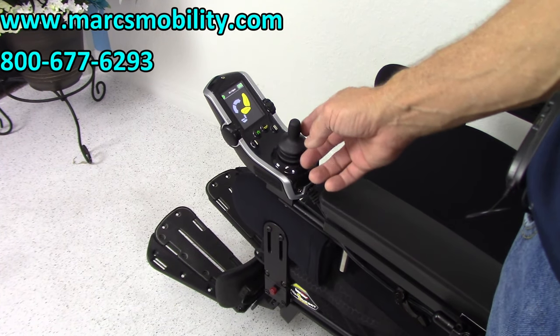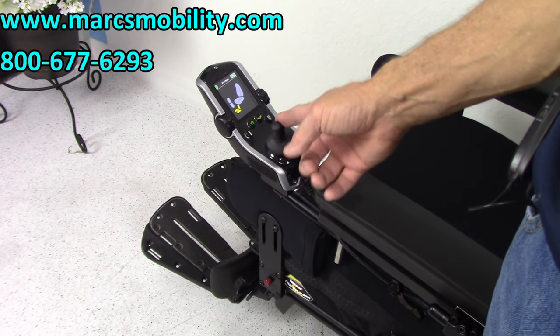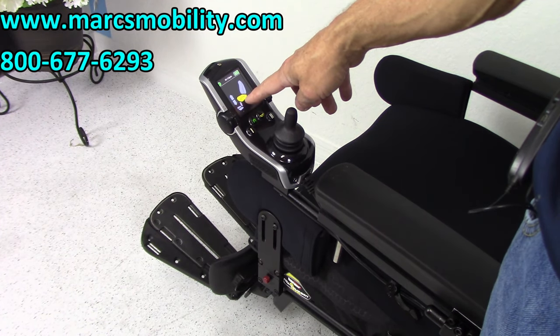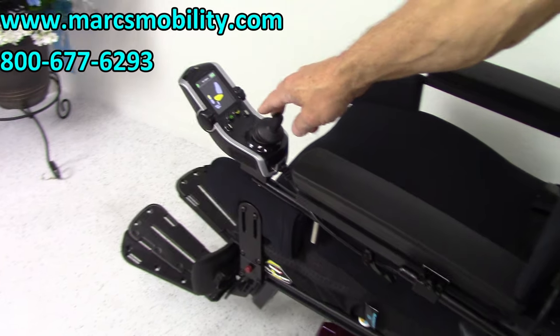So this is the tilt — move the joystick sideways. This is the tilt and the legs together. This is just the legs. And this is only the seat lift — that's the first one I'm going to show you. Once you have it on that seat picture, you would push the joystick back and your seat will start going up.